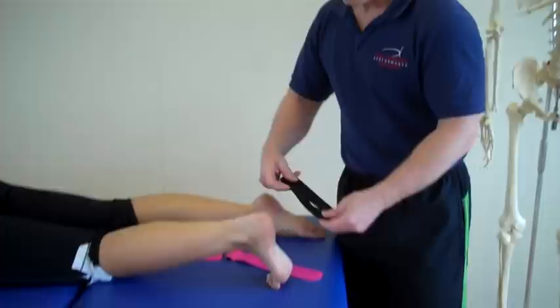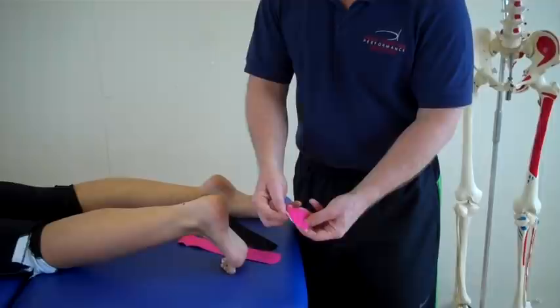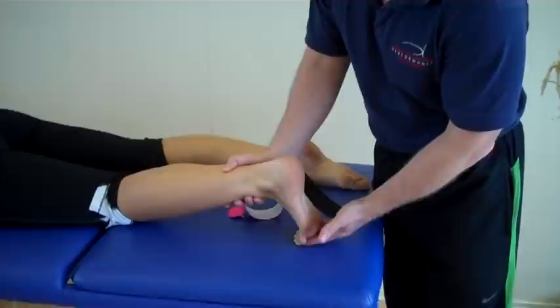We're going to use three types of tape. We've got an I-strip, an I-strip that's been split, so we call that a Y-strip, and then a smaller piece that's split and we call that an X-strip.